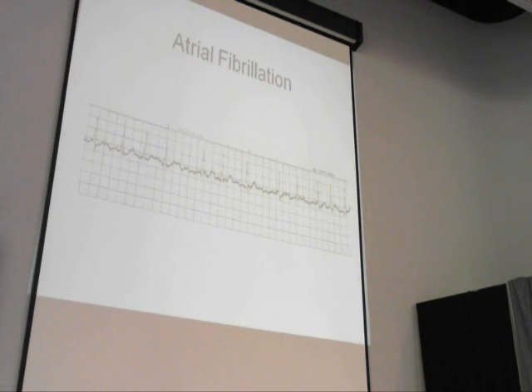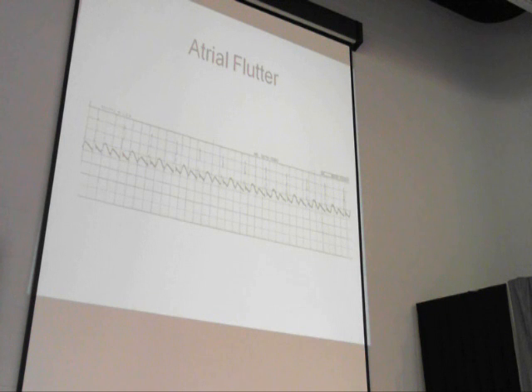That's atrial fib. Atrial fibrillation is probably the most common in the elderly population. Again, healthy hearts don't get fib. Is the ventricular rhythm anywhere remotely regular in fib? No. But in flutter, your ventricular cadence is regular, and in this illustration there are just 3 flutter waves in front of every QRS.